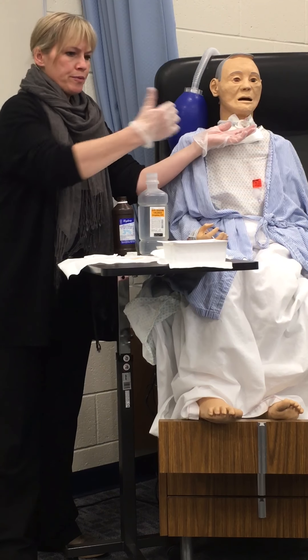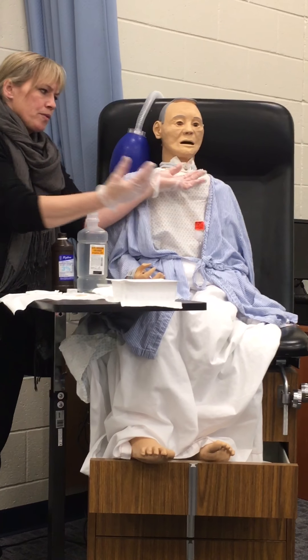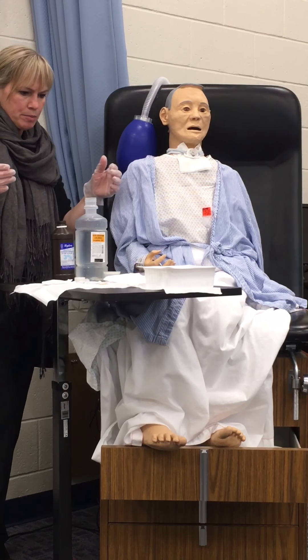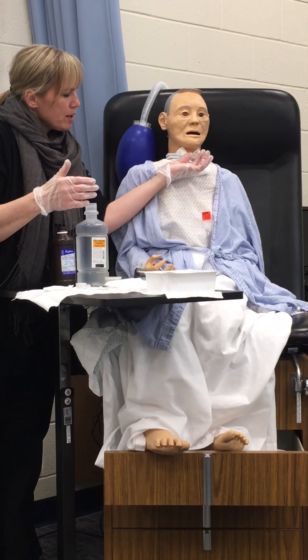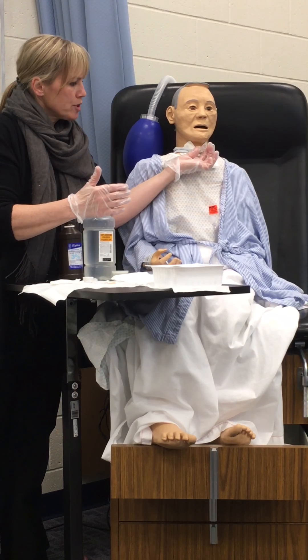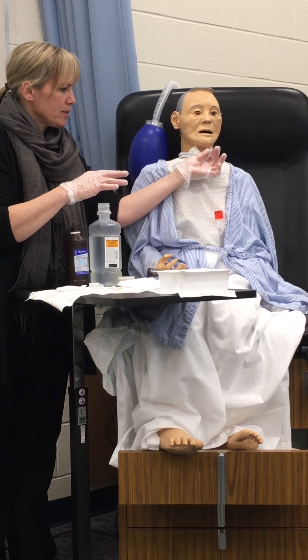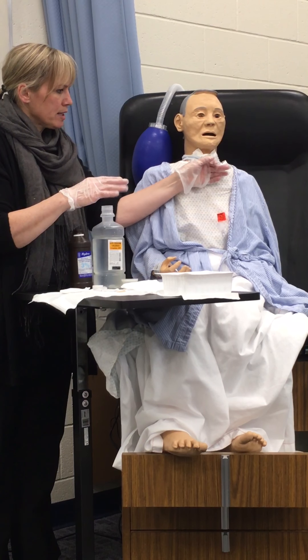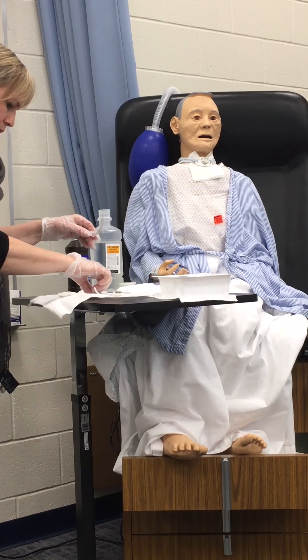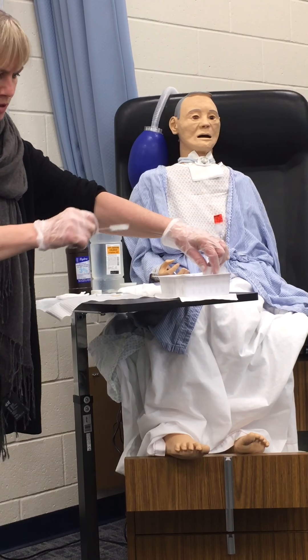Non-sterile and then sterile — sterile is going to hold the inner cannula and hold all this stuff. I would be facing Jane and looking right at her and do this pinch. What I would do is go across, but then I'd have to move my field because I don't want to be crossing my sterile field. Jane, now I'm going to take this inner cannula out. I try to do like 30 seconds, minute tops, because I want to put it back in. Just breathe normally. This hand really can only legally touch this — it comes out like a little rainbow action. This is my sterile piece.